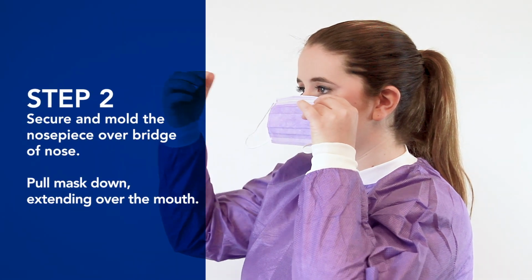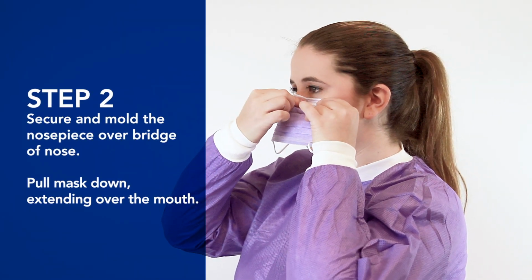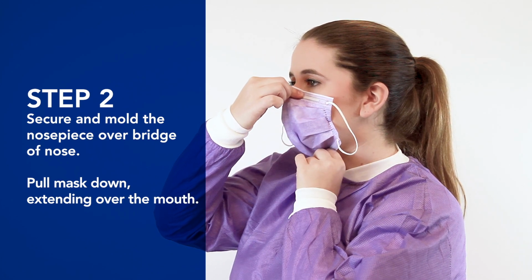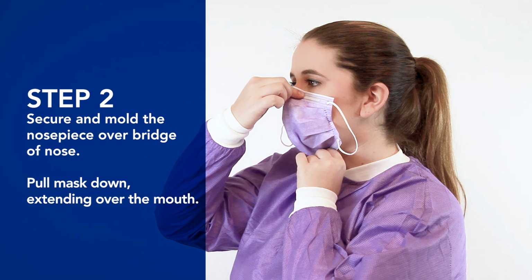Step 2. Secure and mold the nose piece over the bridge of your nose. From the bottom, pull the mask down, extending it over your mouth.